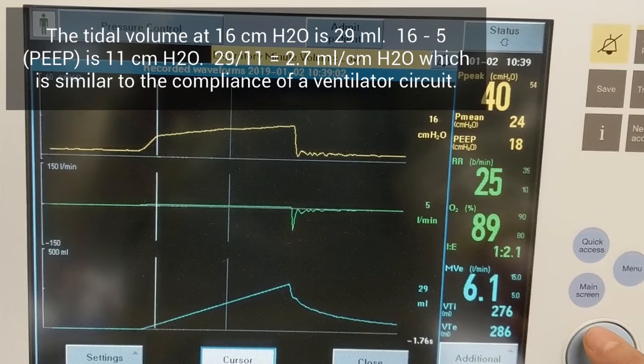In this example, the pressure at the inflection point is 16. The original PEEP was 5, so the difference in pressure is 11 cm of water. The mls delivered at that point is 29 mls as shown on the screen. 29 mls divided by 11 cm of water is 2.7 mls per cm of water, which is similar to the compliance of a ventilator circuit.